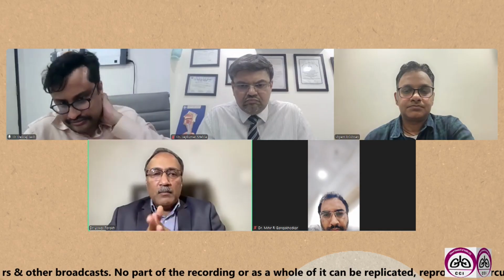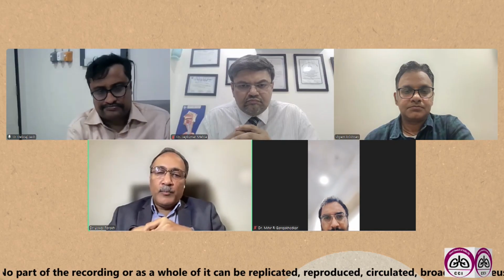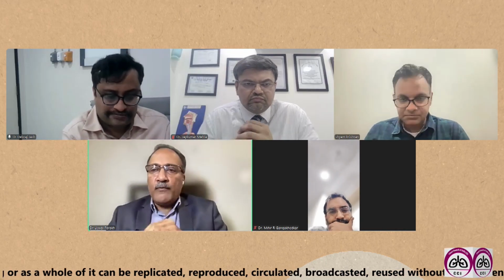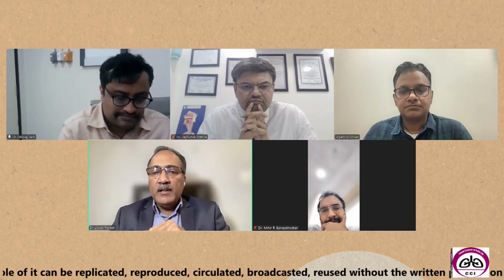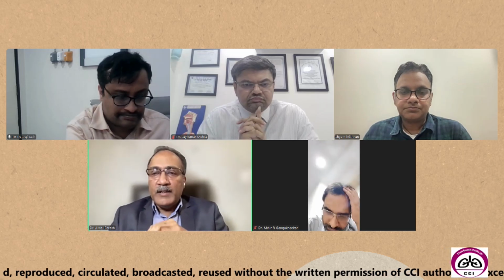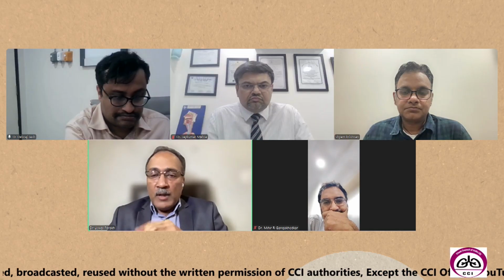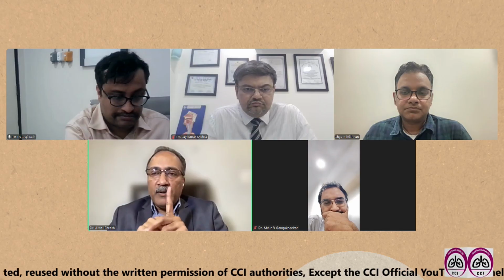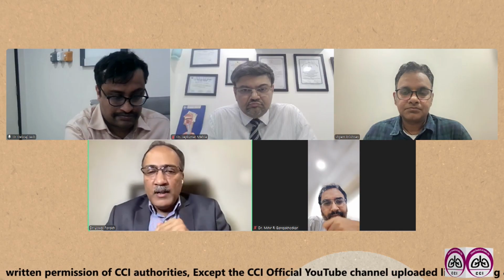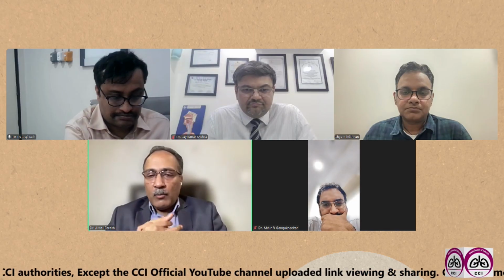See, first of all, the advantage of ROSE is that you can decrease the time that you're spending doing the procedure, especially when you're doing staging. So that is probably the only advantage of doing ROSE. And a pulmonologist can easily learn it. We at our institute have started doing that, and we have found that it's very easy to do, and it can decrease the time that we spend doing the procedure. But we need to identify certain cells, and that's very easy. A few days with a good cytopathologist is good enough to understand what these cells look like, and then you can start doing it in your bronchoscopy suite.